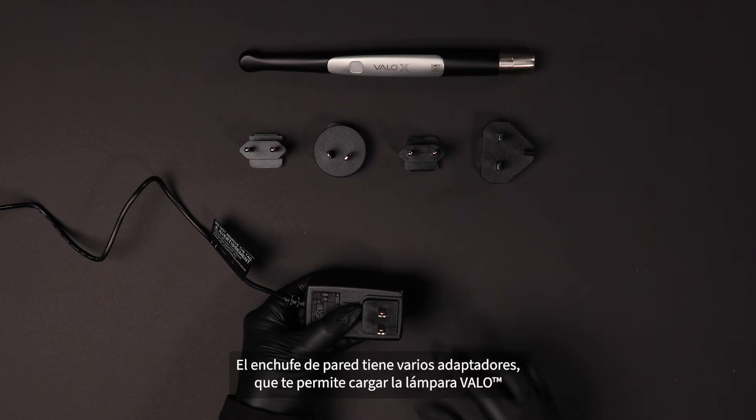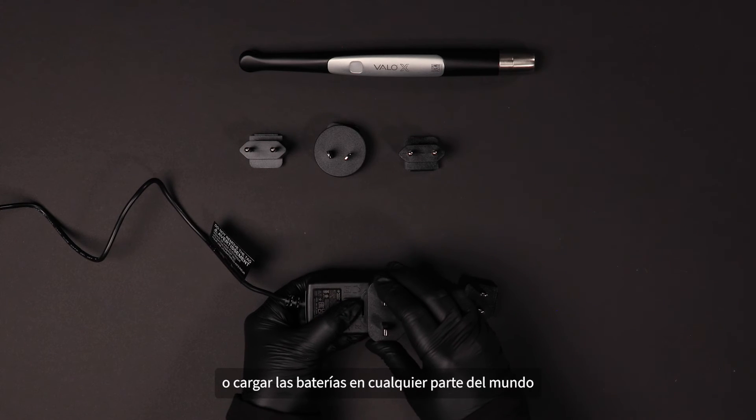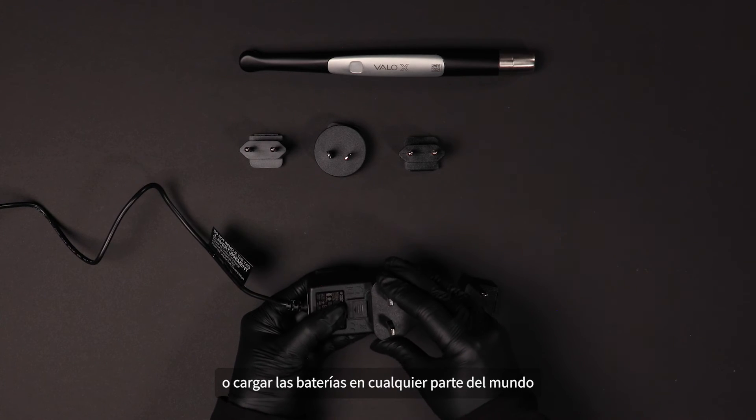The wall plug has several adapters allowing you to power your VALO X Light or charge batteries no matter where on earth you may find yourself.